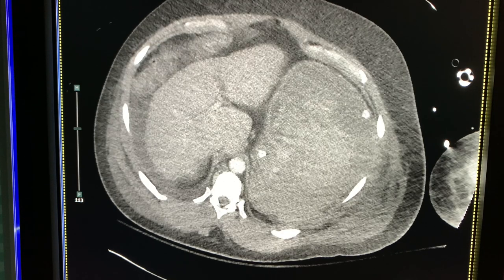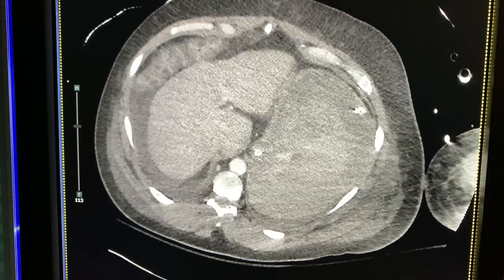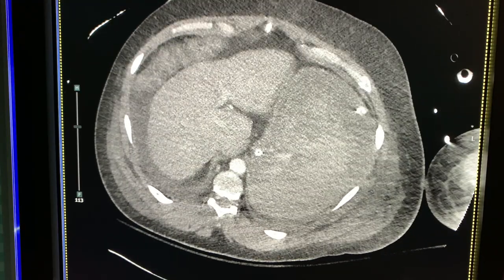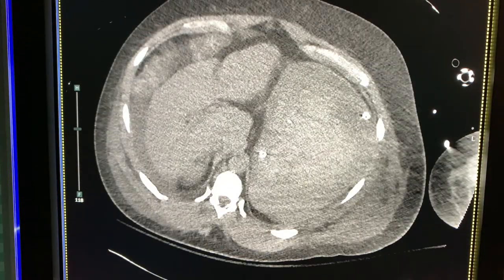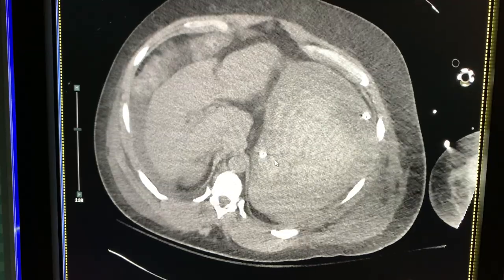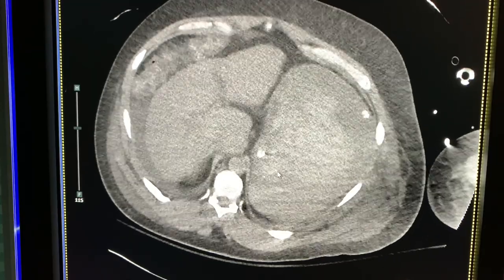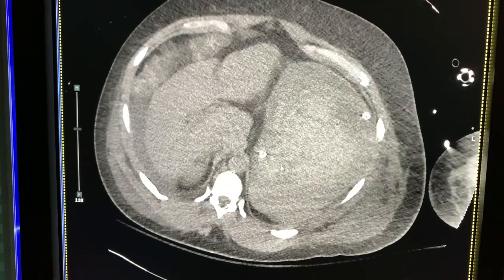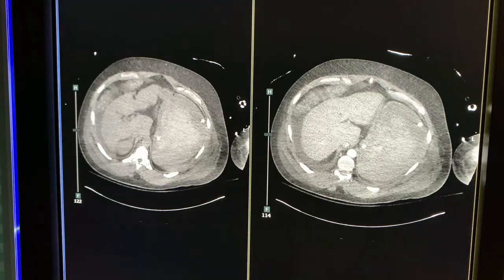You can see the extravasation is a little more hyperdense than the remaining products in the stomach. We know this because on the non-contrast phase in the same region, we do not see it — so it must be extravasated contrast.